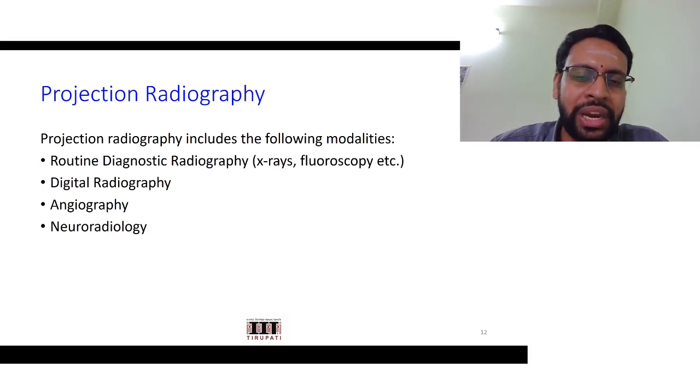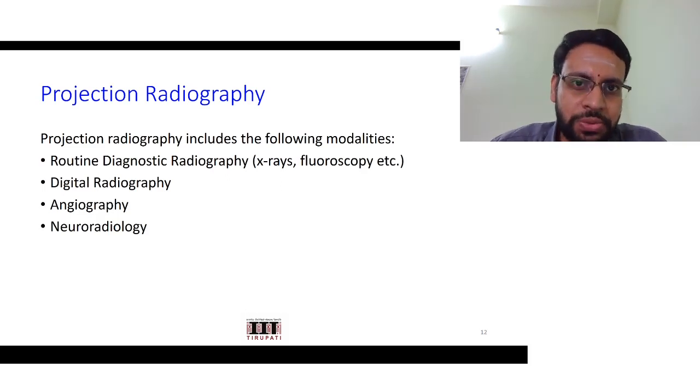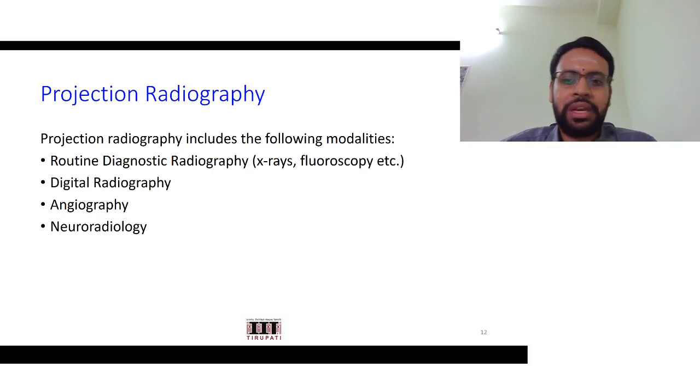Another one, neuroradiology. This is again a specialized X-ray based imaging system, specialized for imaging the skull and the spine.